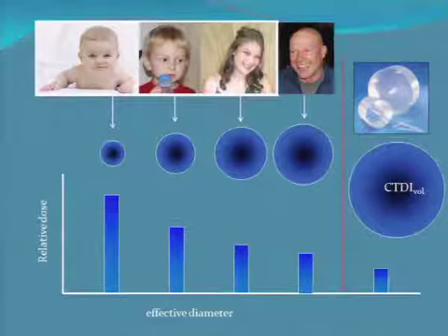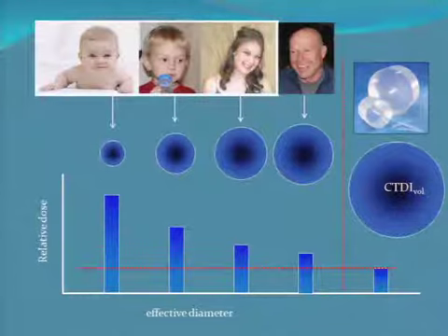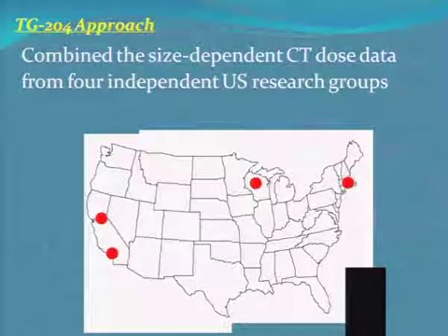And at a cancer center, I kind of expected everybody to be thin and emaciated. Well, that's not true. Very often they kind of bloat up. They change their shape very quickly during treatment, very often in a measurable way, and in a way that the tube current modulation actually recognizes and changes.